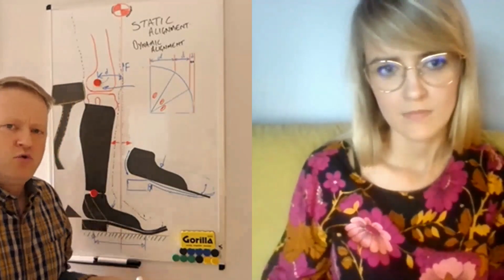Full foot plates are a lot about stance phase control, stance phase stabilisation, allowing a stable entry into swing phase. But if the foot plate's too stiff, as someone else noted, that can cause other issues, people rolling into low gear gait, or perhaps massively hip hitching or compensating to get their leg through. Because if people have got proximal weakness, hamstring tone, anything else which causes them to maintain themselves in a flexed position during gait, or with an inability to offload that leg to go into swing phase, then they will tend to compensate using hip hitching, lateral swing, anything like that, lots of things like that.